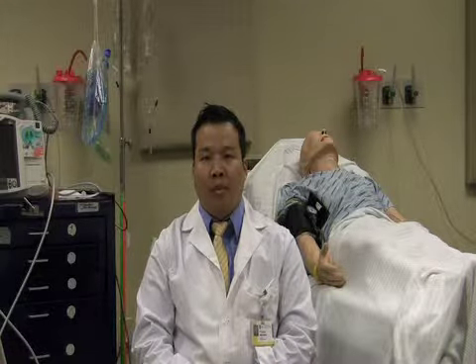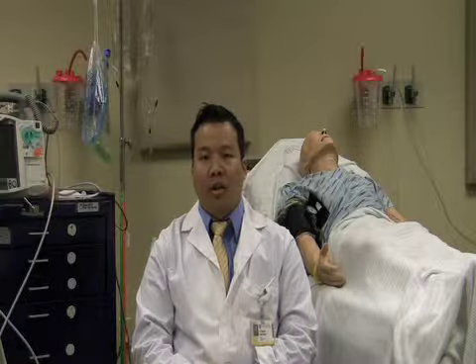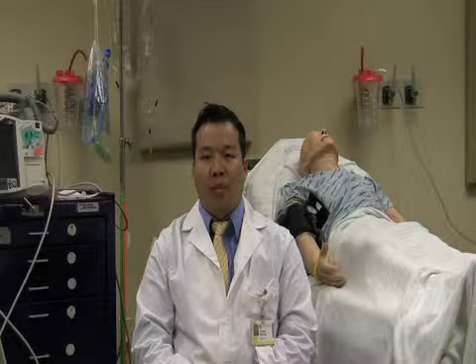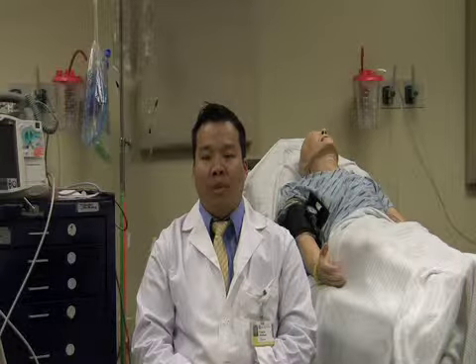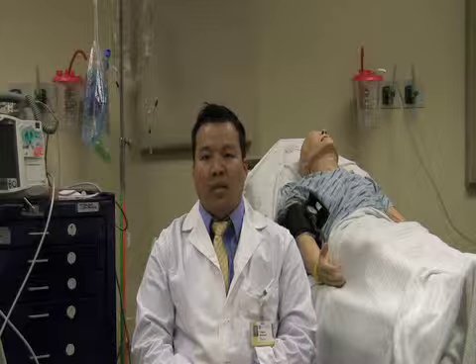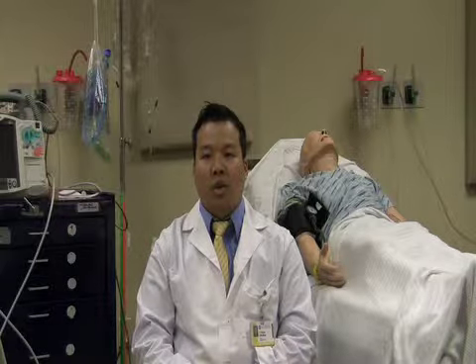Failure of the pulse generator may occur because the battery power is too low, or because there is an abnormality in the sensing of the pacemaker. Lead failures may be represented when there's a failure of pacemaker output. This is represented when a pacemaker potential is not initiated when it actually should be.